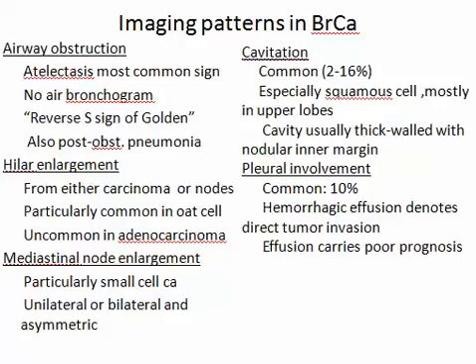So unilateral hyperdensity and unilateral prominence of the hilum, or inequality or asymmetry of the hilum, would suggest bronchogenic carcinoma in old age. This is first. Second, persistent infection in old age for more than 15 days is considered due to underlying malignancy till otherwise proved.